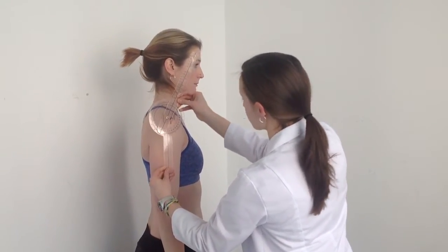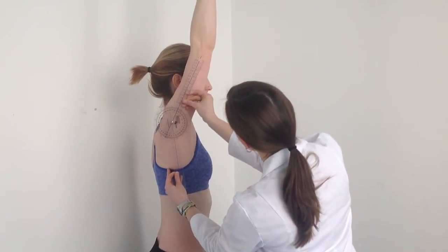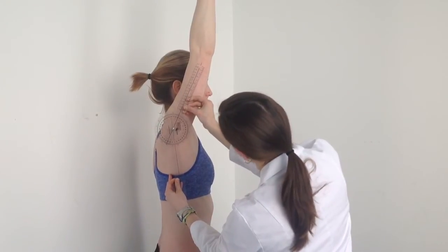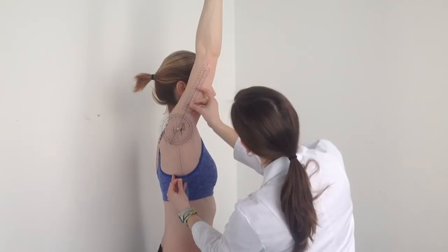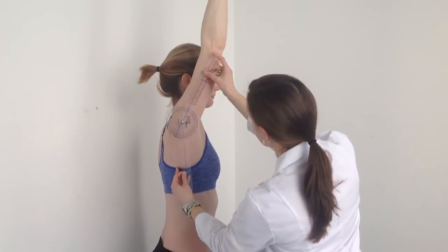All right, go ahead and do that motion one more time. Okay, so that looks like about 150 degrees. Callie's just keeping a finger between the goniometer and Tracy's skin. And come back down.